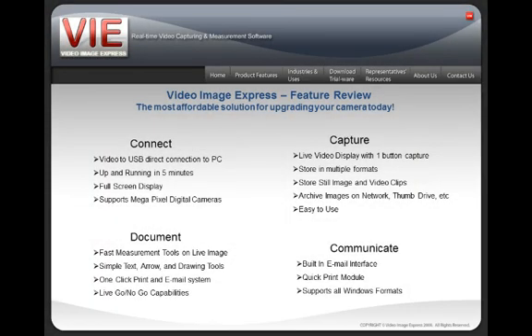Video Image Express is the most affordable solution for upgrading your camera or microscope system today. You can connect to a USB or S-video camera and your scope can be up and running very quickly. We support and sell megapixel cameras, video scopes and microscopes as well. Video Image Express is a fast and easy tool for measurements, capture and communication.